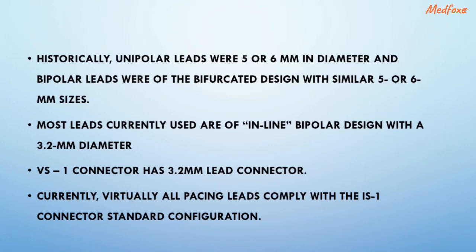Historically, unipolar leads were 5 or 6 millimeters in diameter, and bipolar leads were a bifurcated design with a similar 5 to 6 millimeter size. Most leads currently used are inline bipolar design with a 3.2 millimeter diameter. In 1986, a voluntary standard for lead connectors and connector cavities was established.